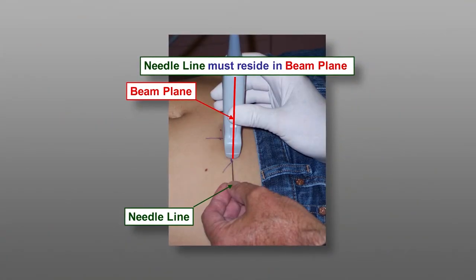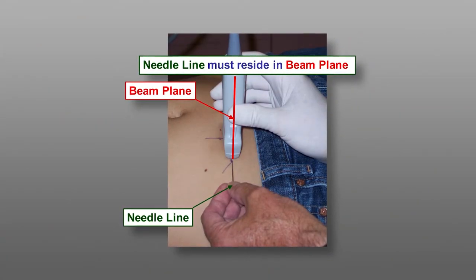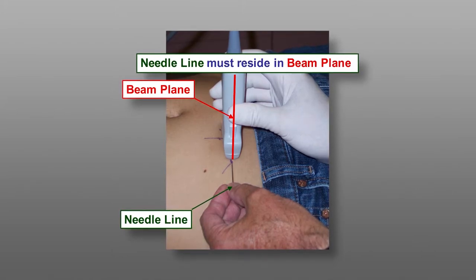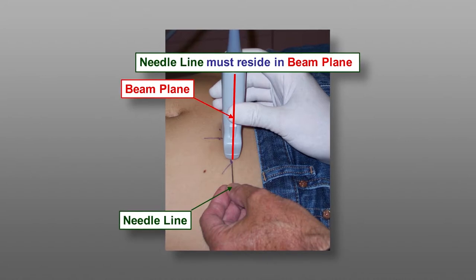After applying local anesthesia, place the needle at the middle of the short side of the probe and with the needle lined up with the probe in order to ensure the needle enters into the narrow field of vision.